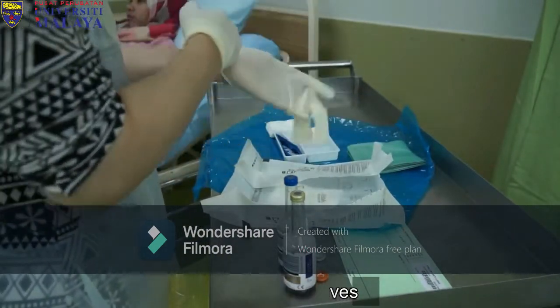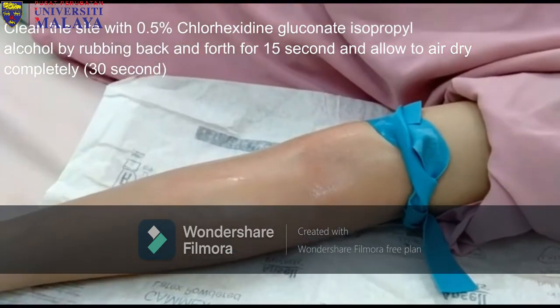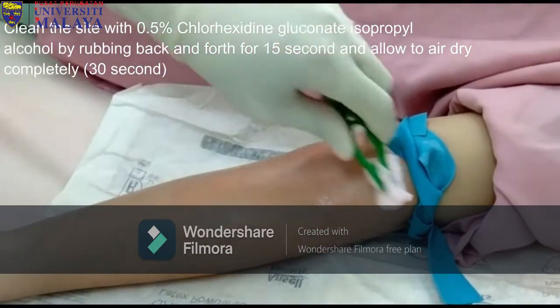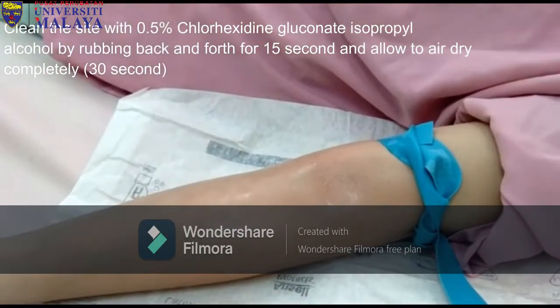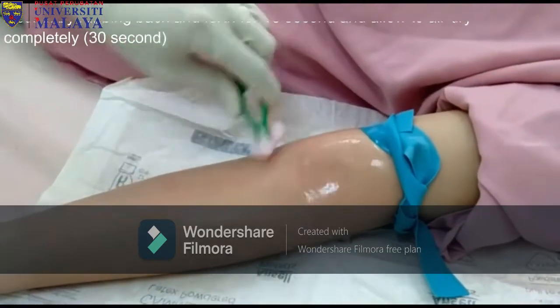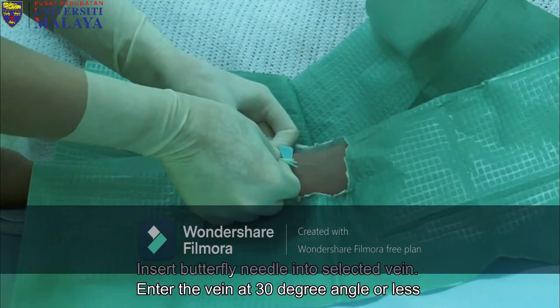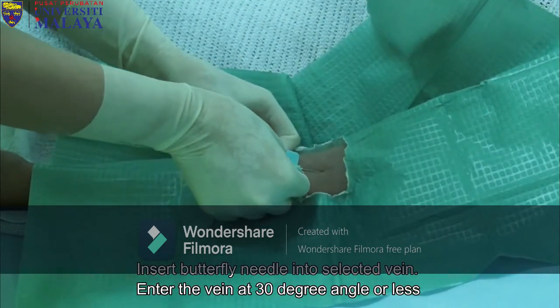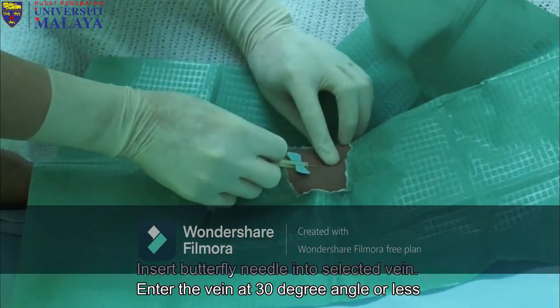Wear sterile gloves. Clean the site with 0.5% chlorhexidine gluconate isopropyl alcohol by rubbing back and forth for 15 seconds and allow to air dry completely. Insert the butterfly needle into the selected vein. Enter the vein at a 30-degree angle or less.